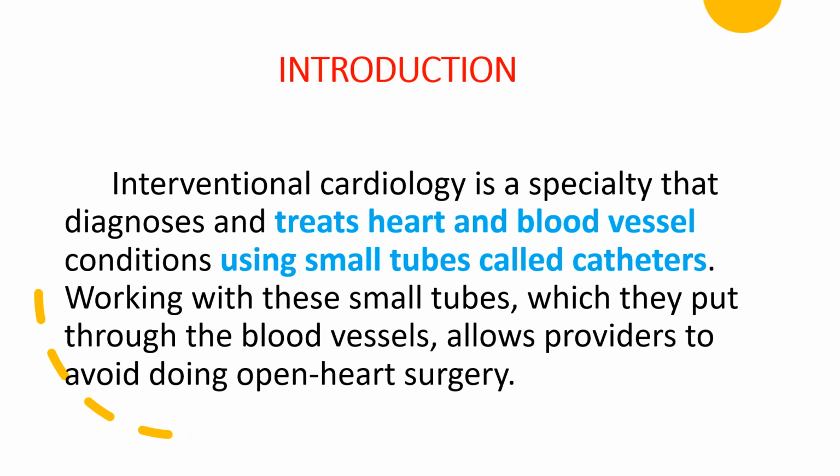So it is mainly used to diagnose and treat heart or blood vessel conditions by using small tubes called coronary catheters that will be inserted via the brachial or radial artery.